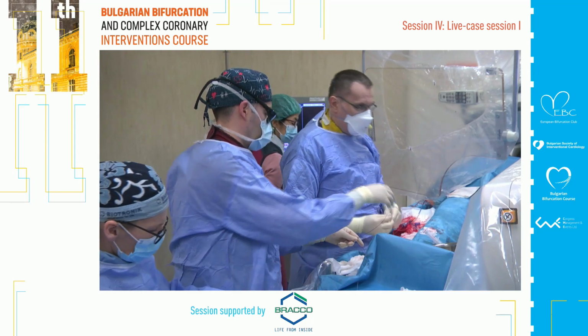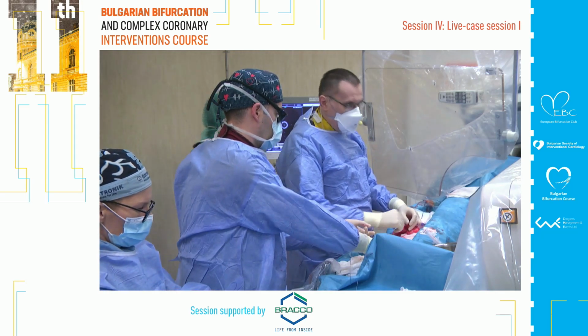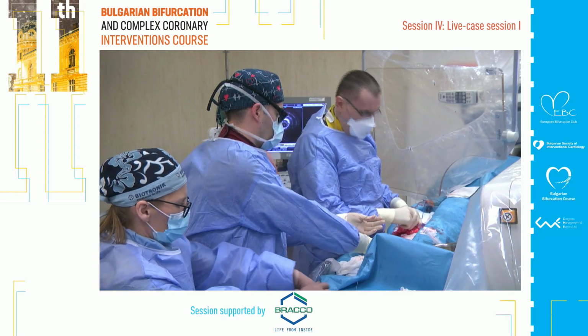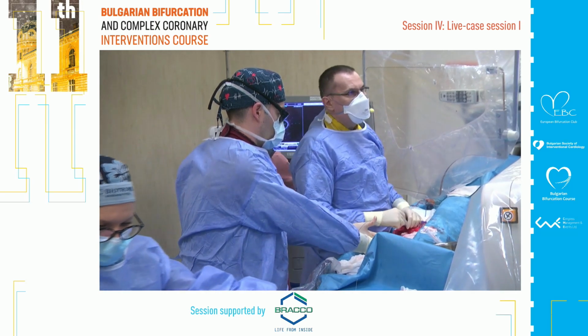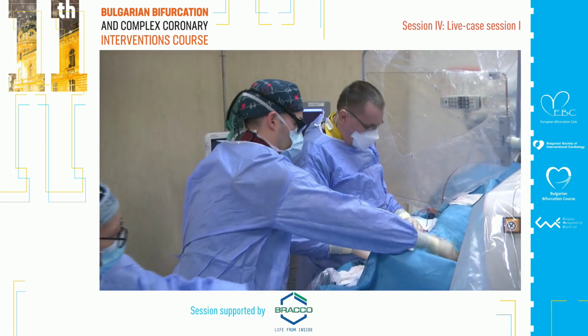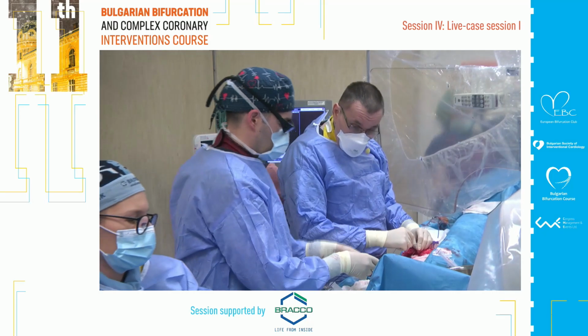But you know, I know Dobrin longer than you. He is a minimal invasive interventional cardiologist, so he believes in balloons and stents. The patient is stable. The blood pressure is stable. No changes in ECG.